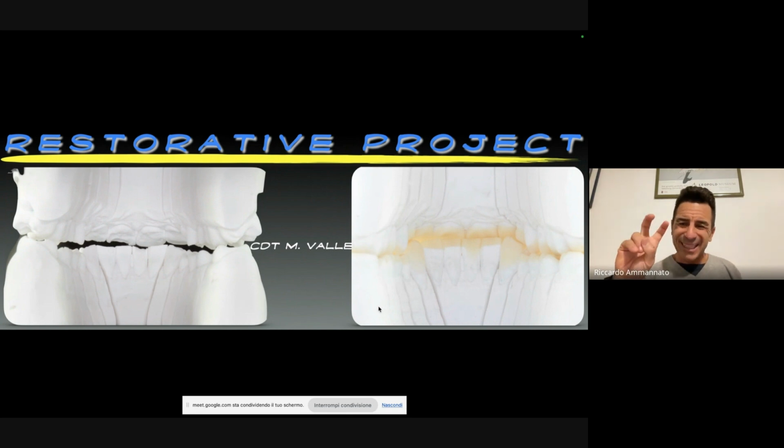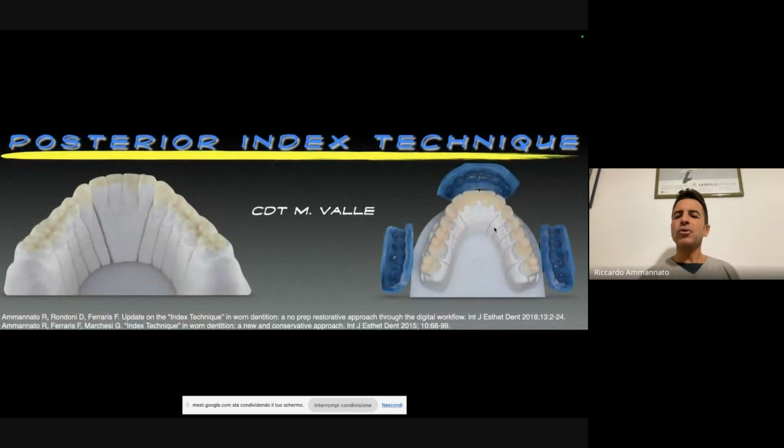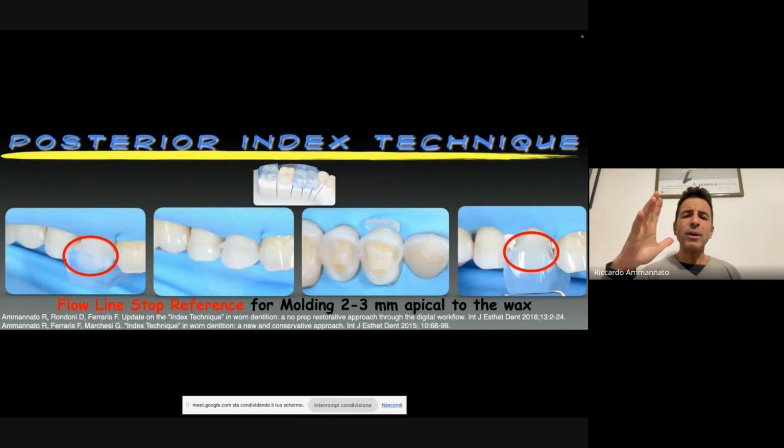And you see it from the technician's perspective, and this is the project, via WhatsApp, because this is full analog. Usually the technician delivers to the clinic the indexes. I have indexes that are full for each sextant, upper and lower, because I'm going to use them as they are, as you see them here, to do the mock-ups, to do the provisionals, to test the static, the dynamic, the function, the phonetics, and everything, like we do in regular prosthodontics. Then when we have done all the test drive and we are okay, we place our definitive restoration.